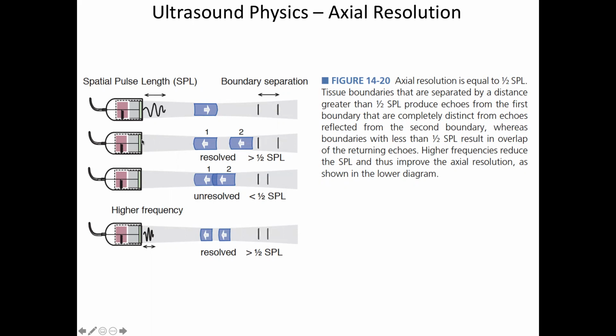When they come back to the transducer, we flip it into listening mode. The compression of the crystal by these pulses will cause a voltage, and we'll measure that voltage. So the signal that comes back will still be at the fundamental frequency, say 1 megahertz or 2 megahertz, whatever it is.